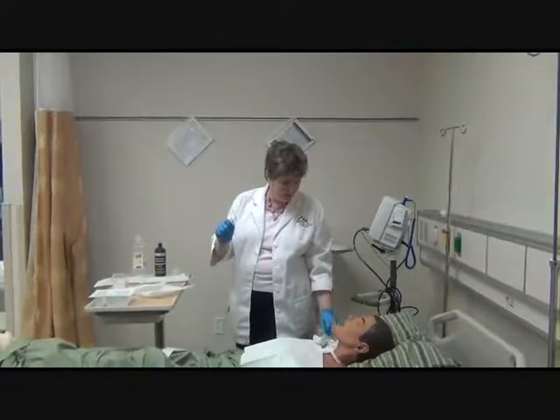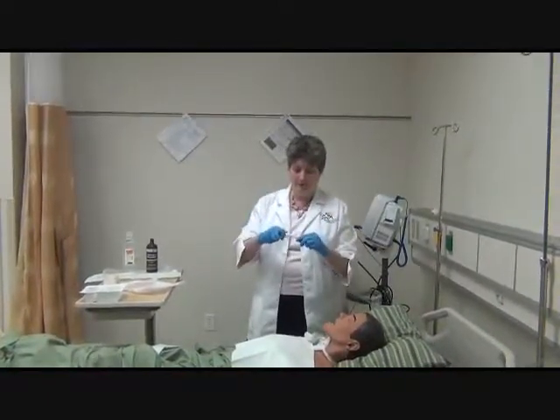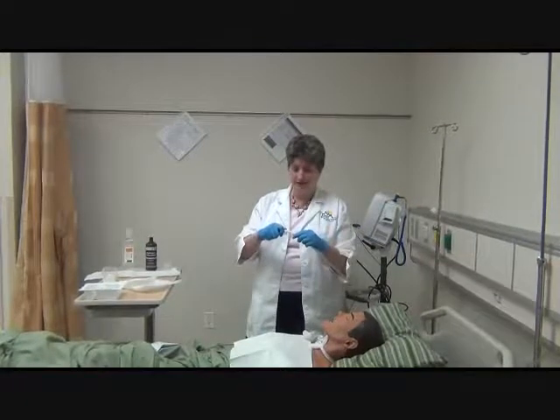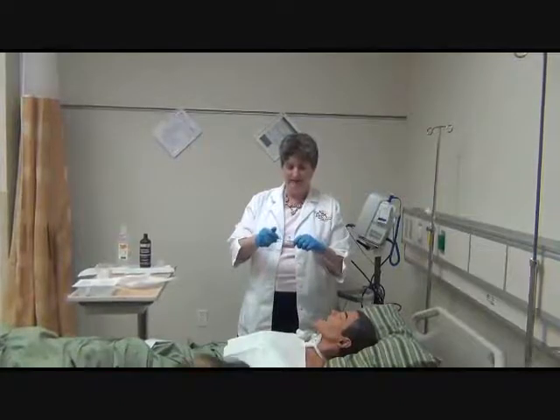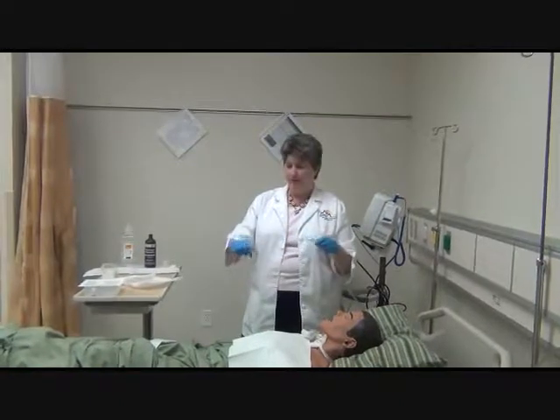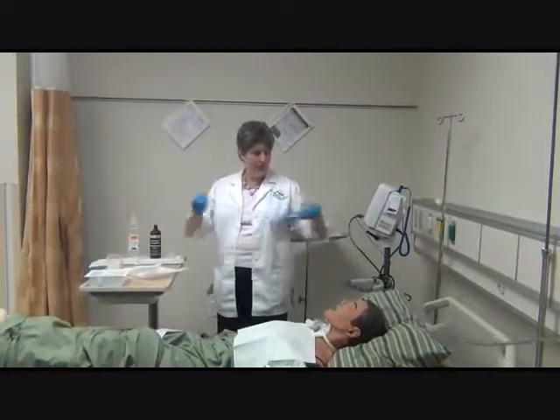And I'm going to, with my non-sterile hand, pick up my hose. I'm going to turn on my machine again. I'm going to connect these. And at this point, then I want to make sure that I am going to suck up fluid.